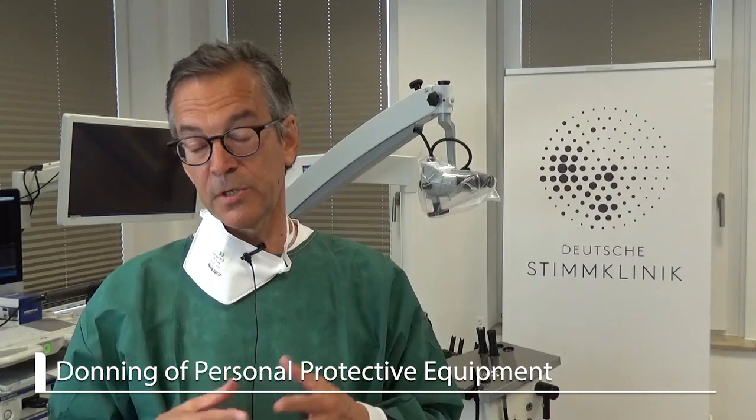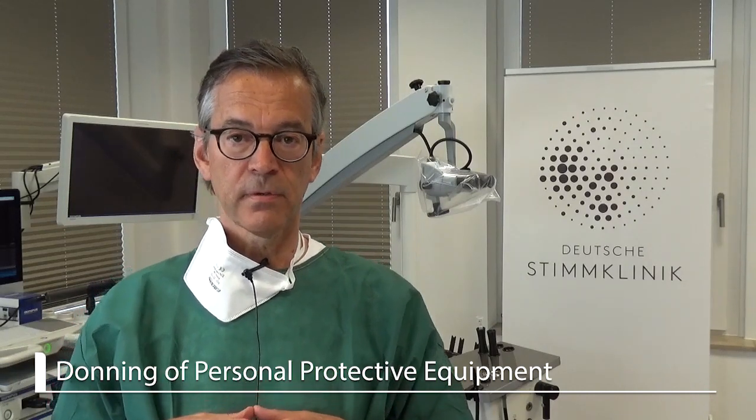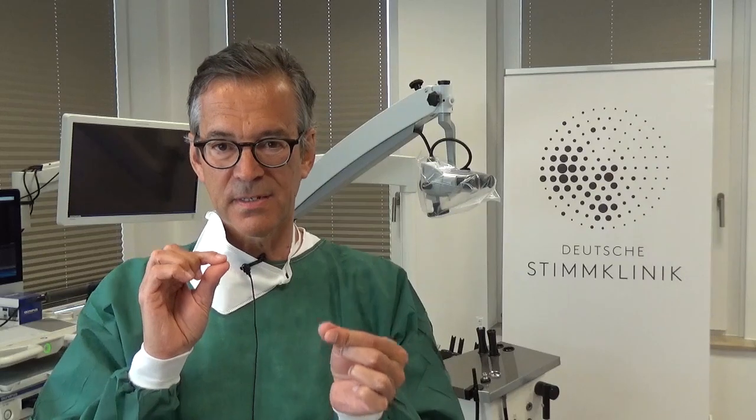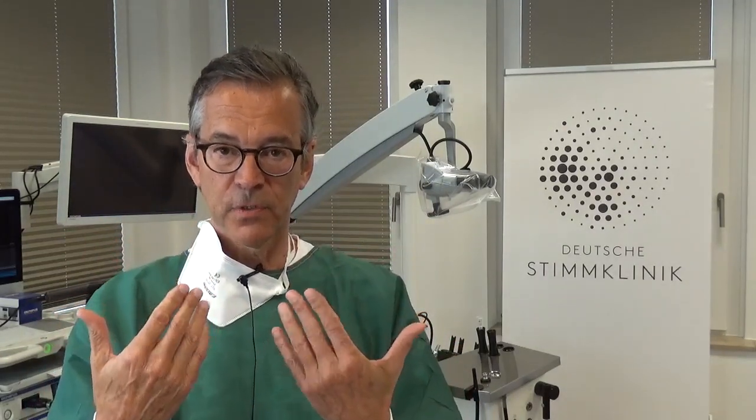Before we go into endoscopy of our patients, we should address one or two things about coronavirus and endoscopy. We know that the reservoir of the virus is in our nasopharynx, in the nose, and in the upper respiratory tract. Going through this tract transnasally is dangerous — not the going through with the endoscope itself, but when you take the endoscope out, or if the patient sneezes and coughs right in front of you. Getting a heavy viral load, a high concentration of droplets into your face so that you as an examiner inhale that, is really dangerous.